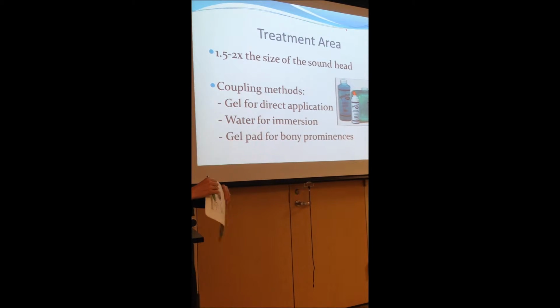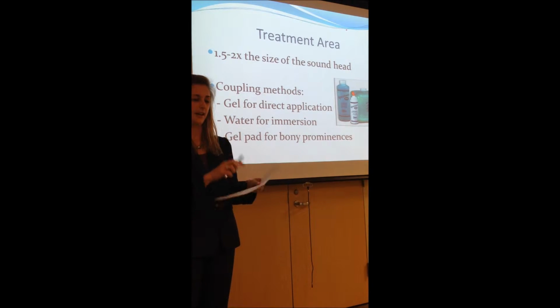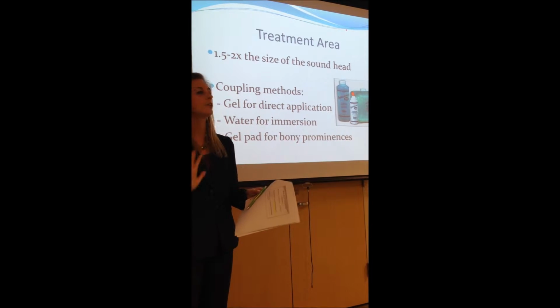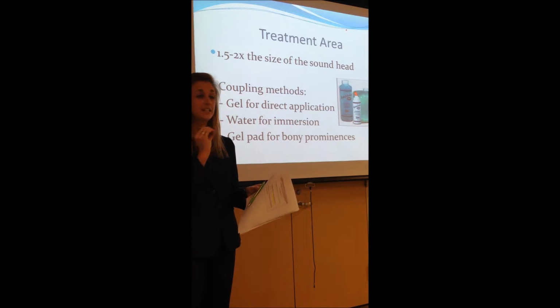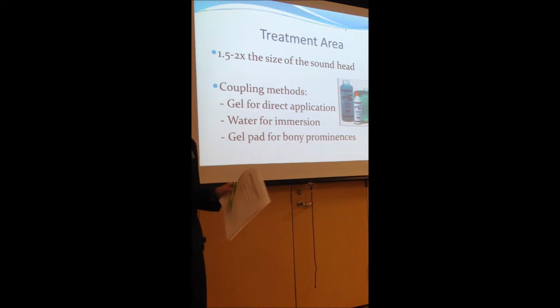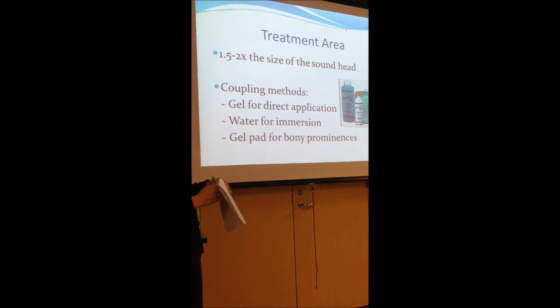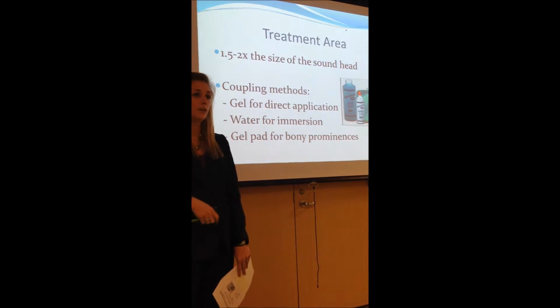Okay, treatment area. 1.5 to 2 times the size of the ultrasound head. So we have our ultrasound head here, and we're only going about 1.5 to 2 times this. We're not going to the car wash here. Small circles, and continuous movement is key. If we stay in one spot too long, your patient might feel a zap and it'll make them uncomfortable, so we do not want to do that. And again, here are our methods: the gels, water, gel pad, and again, the PT should specify what they want.